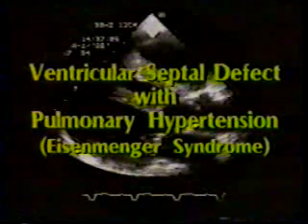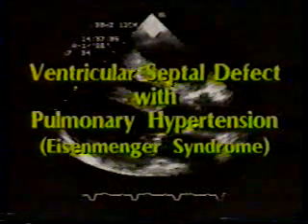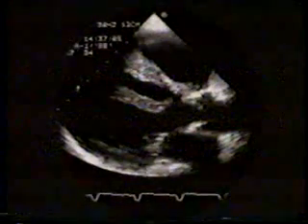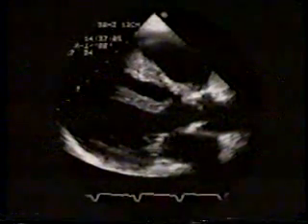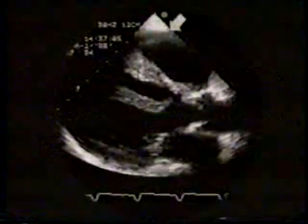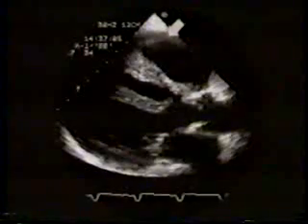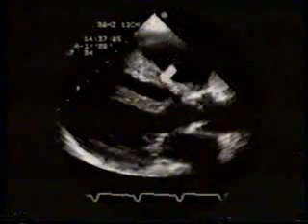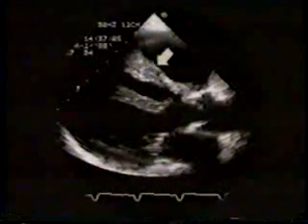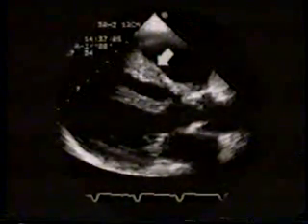We will now demonstrate the features of ventricular septal defect with severe pulmonary hypertension. This is a parasternal long axis view of a 37-year-old patient. Features to note include markedly hypertrophied right ventricular free wall, dilated right ventricular chamber, marked hypertrophy of the anterior papillary muscle.